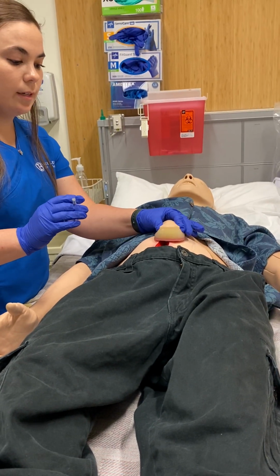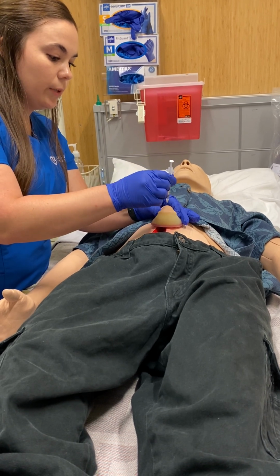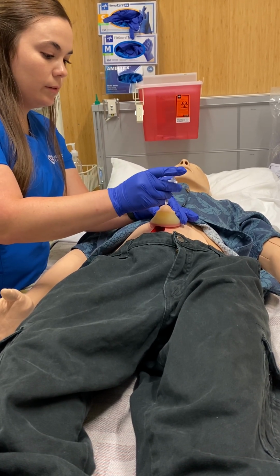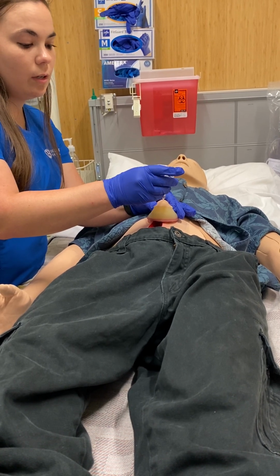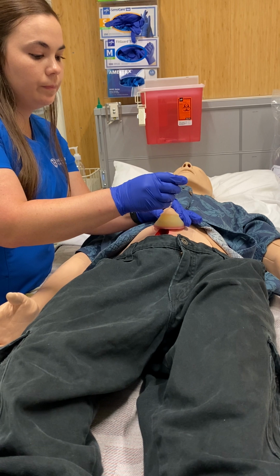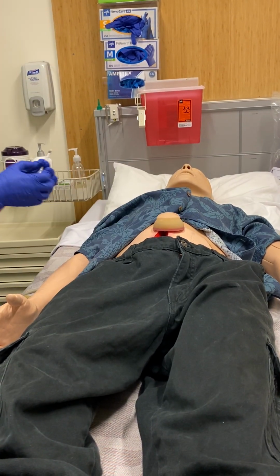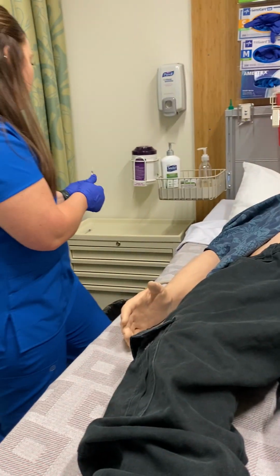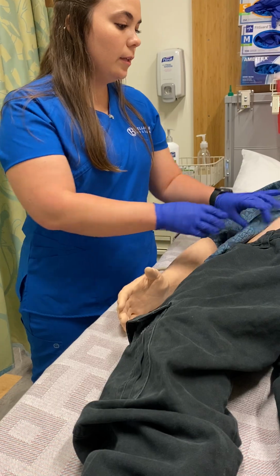You'd pinch the skin here and then administer dart-like straight into the middle at a 45-degree angle. Administer. You could stabilize with your non-dominant hand if that was a preference. You'd withdraw at the exact same angle, put your safety device on, and put that into the sharps container, and make sure that there's no bleeding.